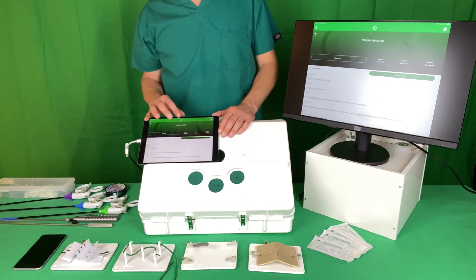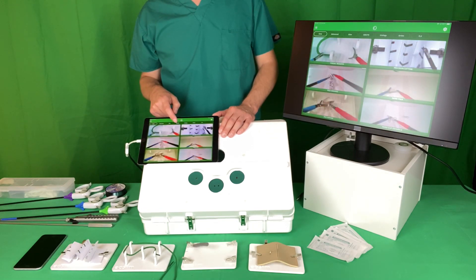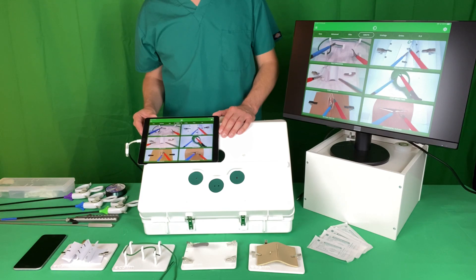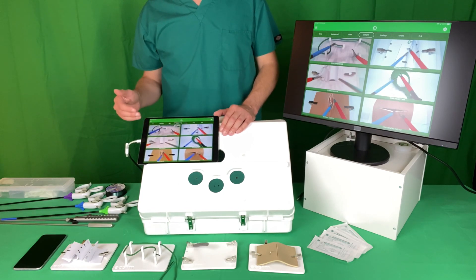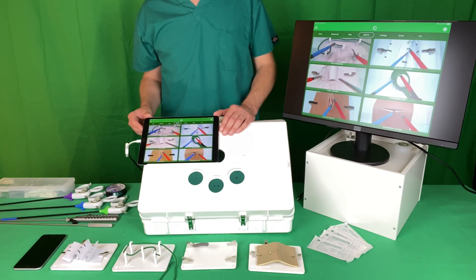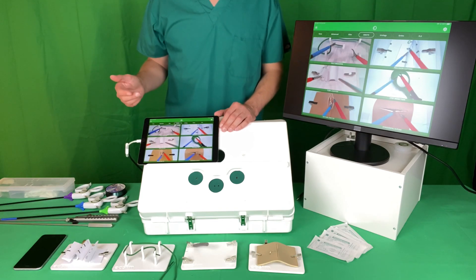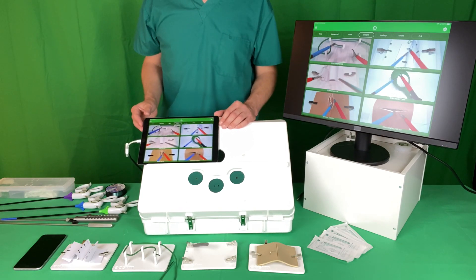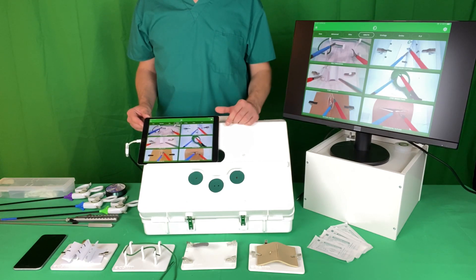The course that you are doing is the OBGYN course. This is six modules starting with basic skills advancing to more advanced laparoscopic suturing tasks. The aim of this course is that you complete all six of these modules within the target time frame.